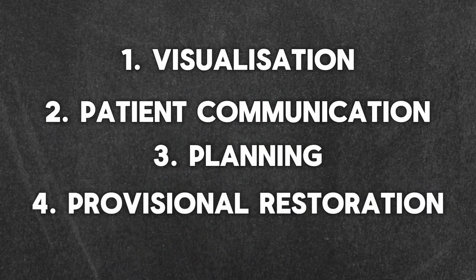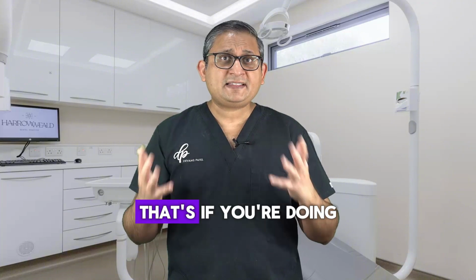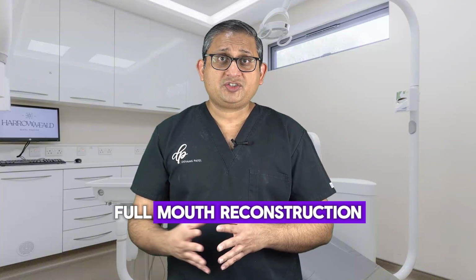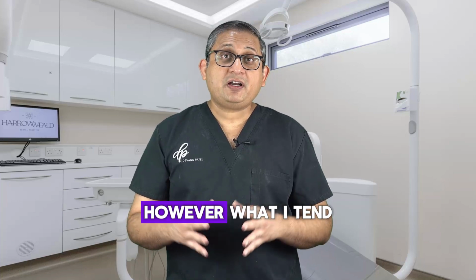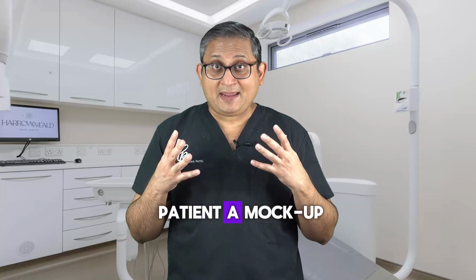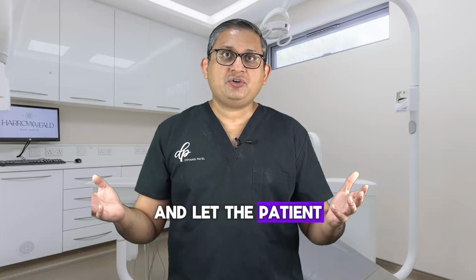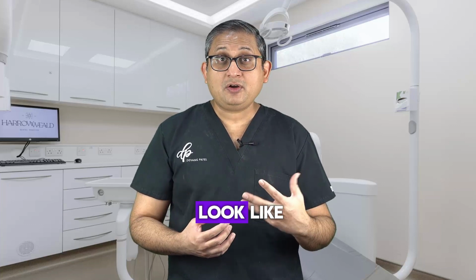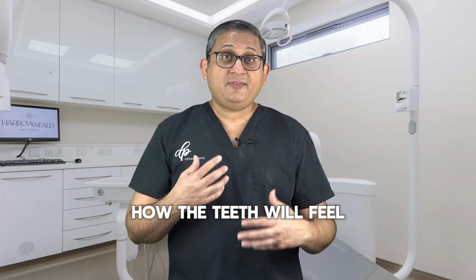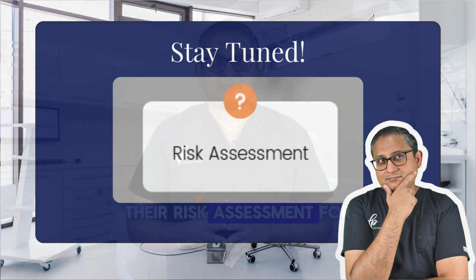Number 4 is provisional restoration. Again, when you are doing a diagnostic wax-up, let's say you're doing a direct full mouth reconstruction, most of the time there is no provisional restoration. However, what I tend to do is give the patient a mock-up using my diagnostic wax-up and let the patient go with it, so that the patient has some time to go through how the aesthetic will look, how the teeth will feel, whether they're going to have any issues. I have covered that in more detail in the video on risk assessment for FMR cases.